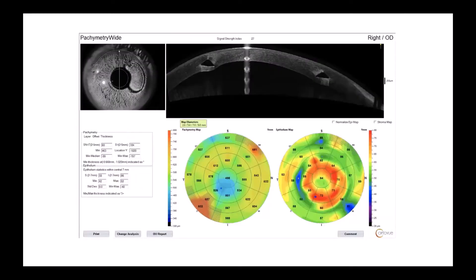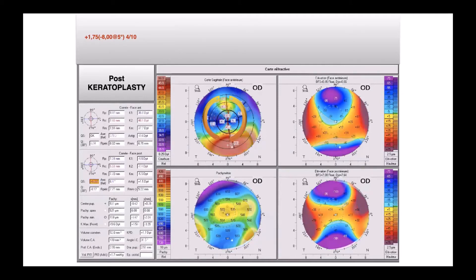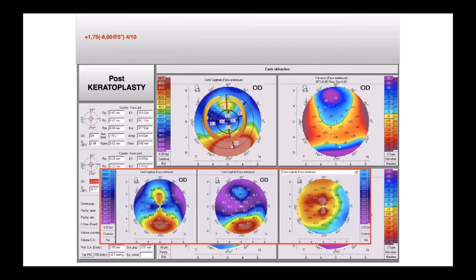As you see here in the OCT, you see the epithelium map, which is very clear. Here is an example of post-keratoplasty astigmatism management. For this case, I used an asymmetric intracorneal ring segment, and the astigmatism goes from minus eight to minus three. You see the differential map at the bottom of the screen.